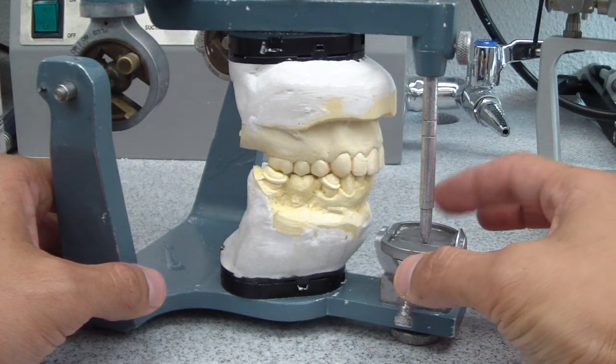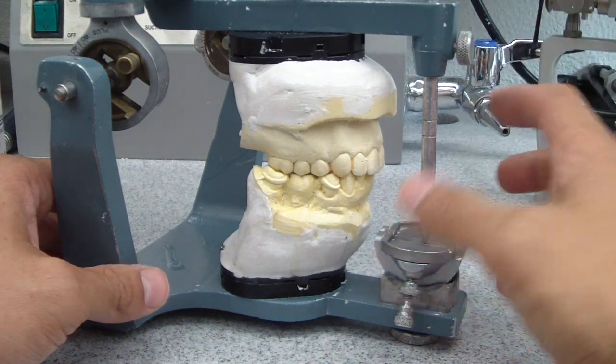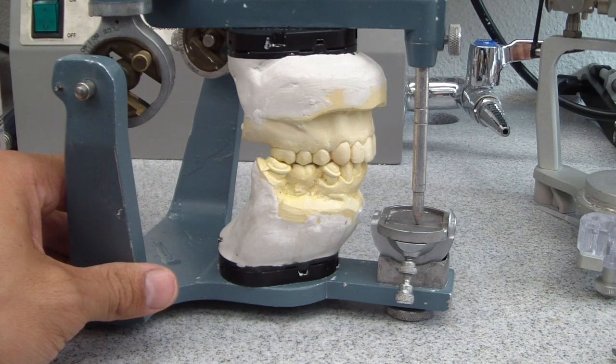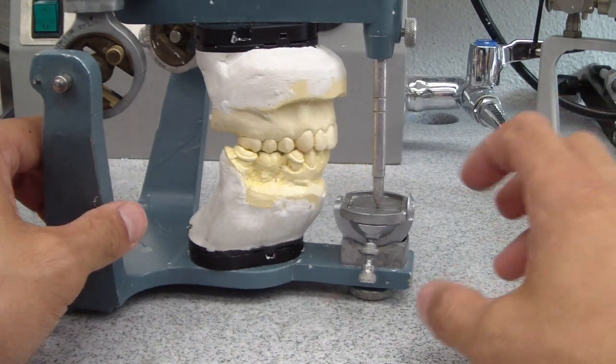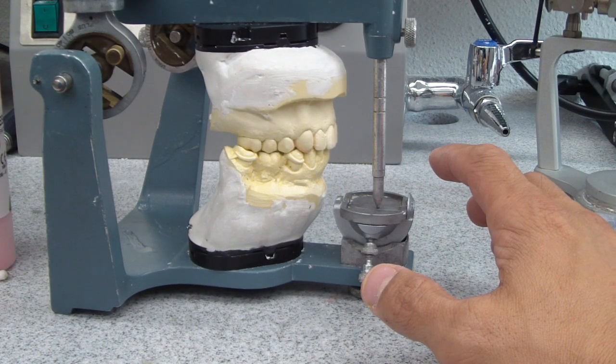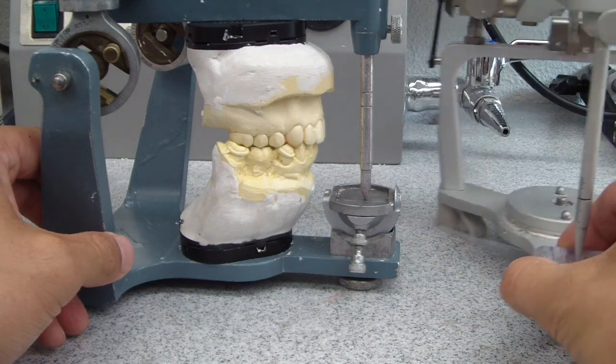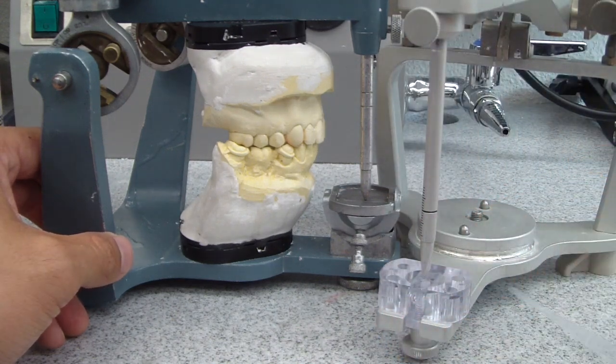So instead of using the machine incisor guide table — you'll see in another video, it doesn't work that well — we're going to develop one with resin. I'm using GC Pattern, but you can use whatever resin, like acrylic. It'd be a little more difficult, but any type of resin that'll work in your hands.